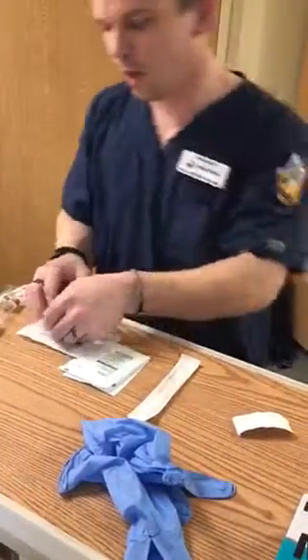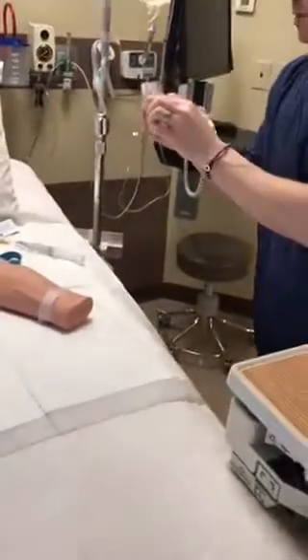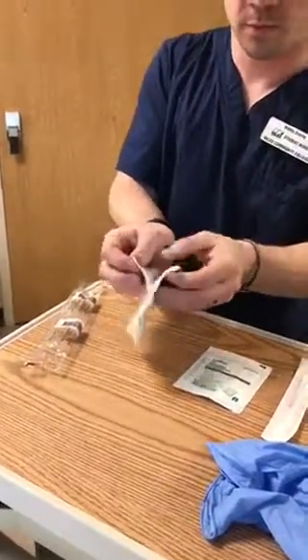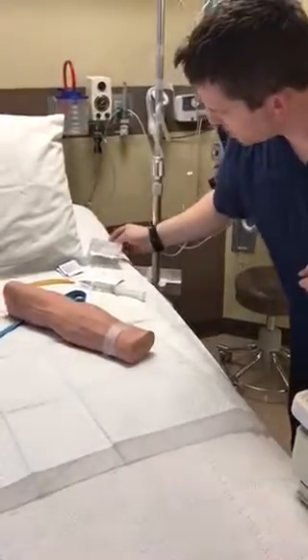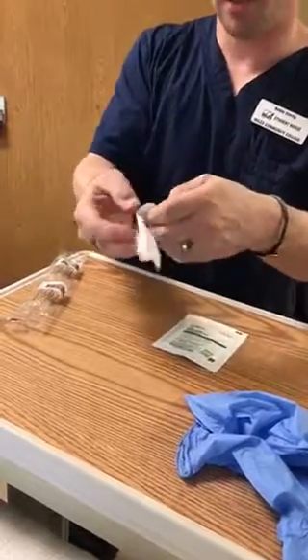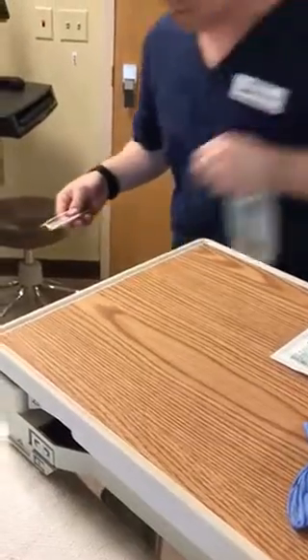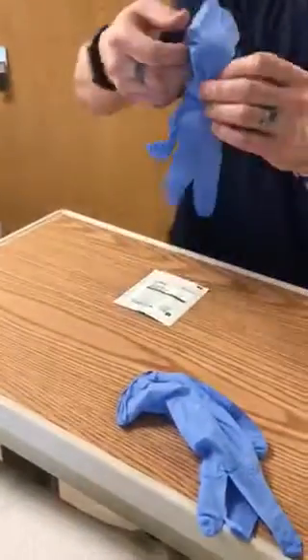I'm going to go ahead and open my clear site here, which I will use to actually have a label already made up for Bob. But I'm going to put that one there. Have that open and set it down there to keep it clean. And I have my IV, which is a 20 gauge IV that I selected earlier. Put those away. And I have my IV still in the gravy boat to keep it clean. I'm gonna go ahead and put my gloves on.